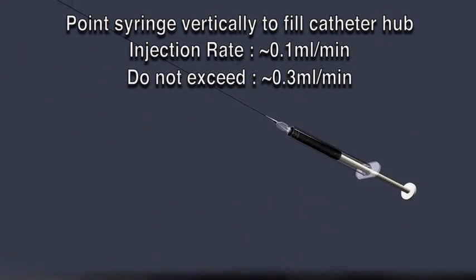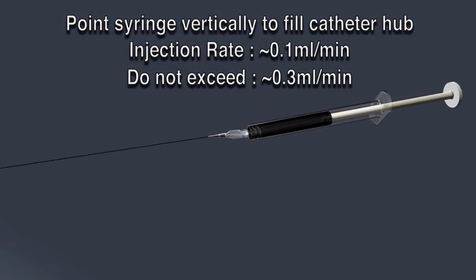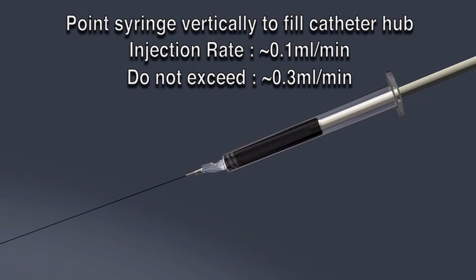Once the Onyx passes through the hub, hold the syringe in a more comfortable position and continue injecting Onyx at the specified rate.